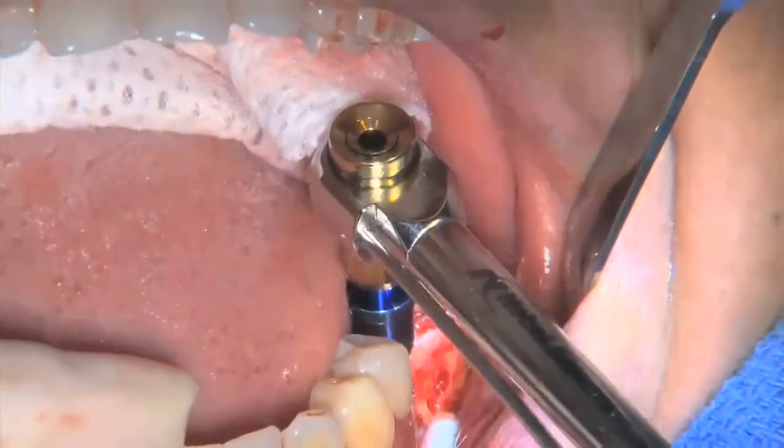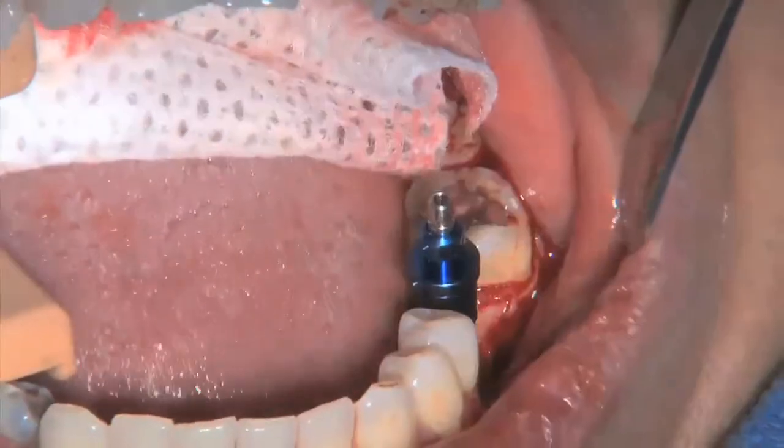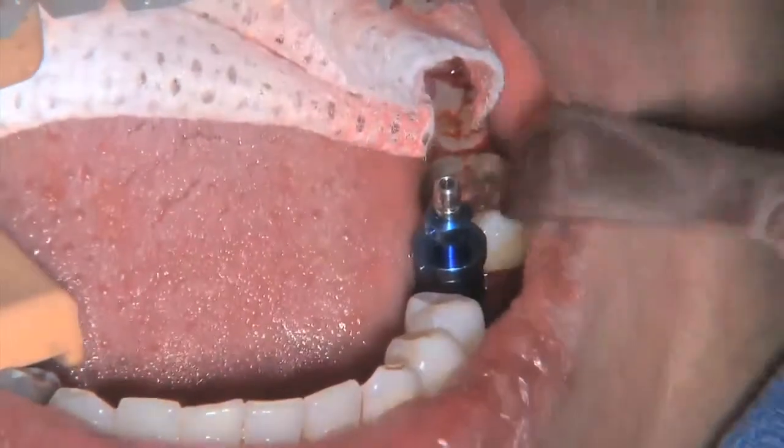One of the divots on the guided implant mount should face to the buccal. This ensures that the internal abutment connection is in the proper rotational orientation.